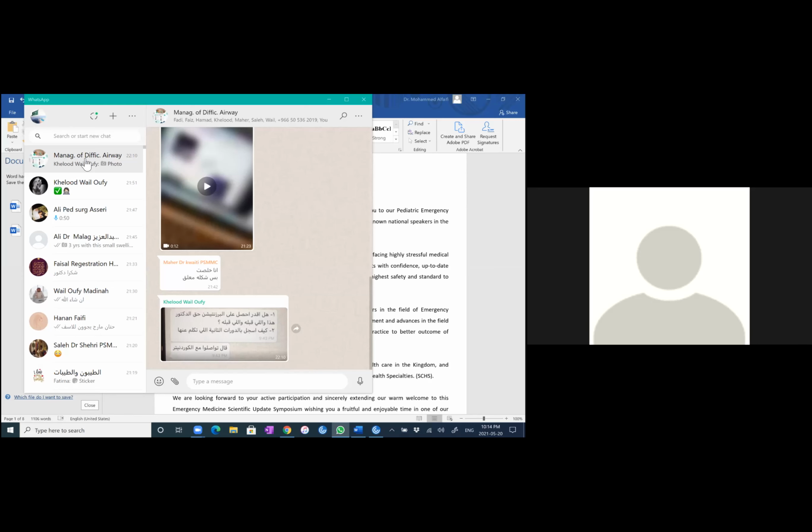Someone asked whether we can use ultrasound in the assessment of retropharyngeal abscess. Yes, it can be, depending on the probe you use. Some call this one a transvaginal probe. You can cover it, and with sterile technique and local anesthesia for the mouth, you can visualize the retropharyngeal space. It is an efficient product for health care providers to serve their patients.